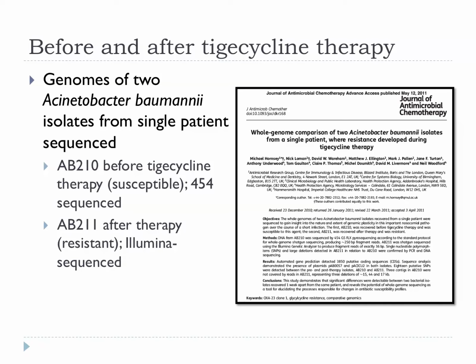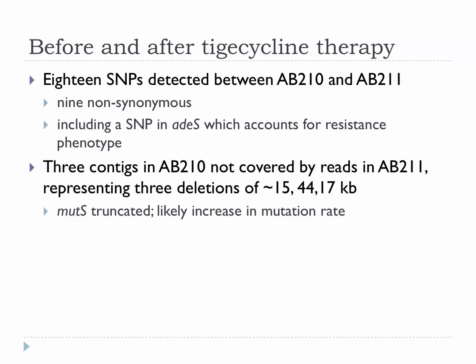So the next thing we did was, with collaborators in London, in the Health Protection Agency and at the Royal London Hospital, we looked at some genomes from isolates from a single patient who had received tigecycline, and before therapy the isolate was sensitive. After therapy it became resistant. And so we wanted to find out what had gone on, what had accounted for that.